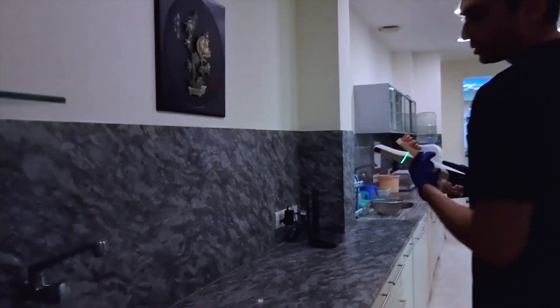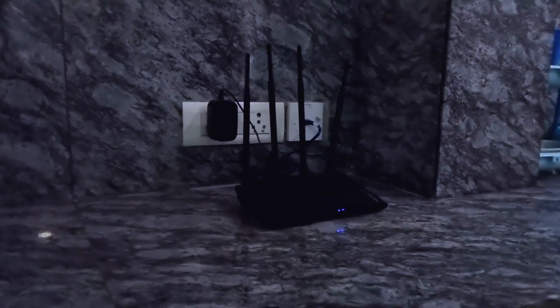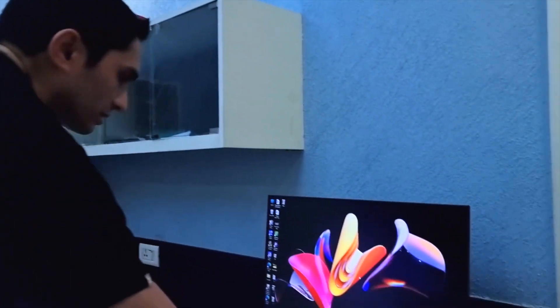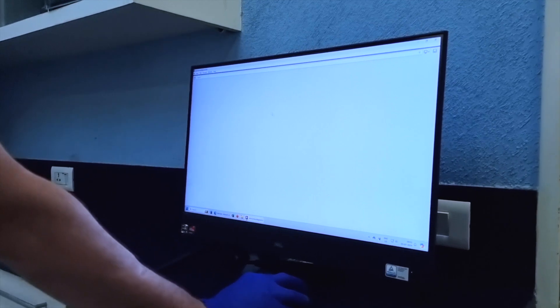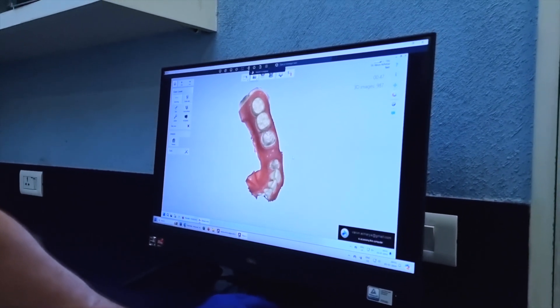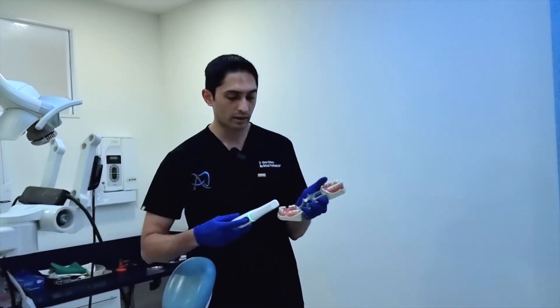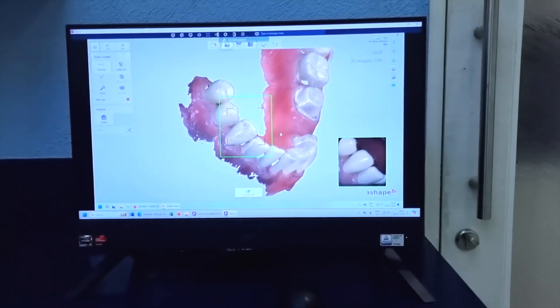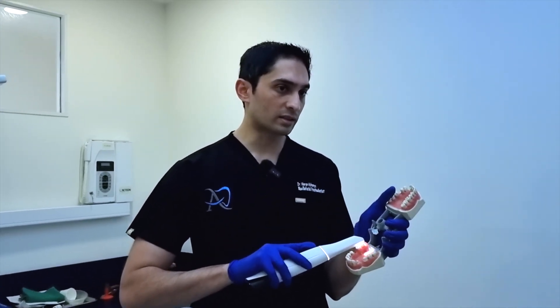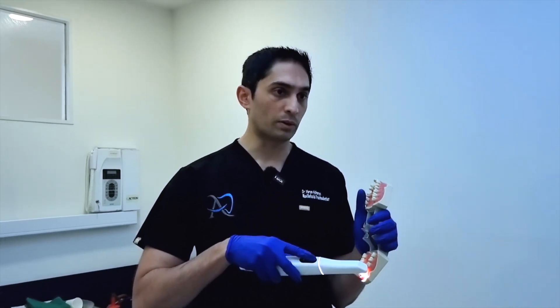In the next room you can see there's another router here in a mesh configuration, acting as a node to the master router in the other room. The first step is opening our screen sharing software — in our case we're using Splashtop — and you can see our TRIOS 5 computer is active. Now we are screen sharing with the powerful computer in that room. I'm going to go to where I would typically work and continue the scan. You can see the scan is proceeding seamlessly because the scanner is connecting to the router just outside this door rather than the one in the first room.